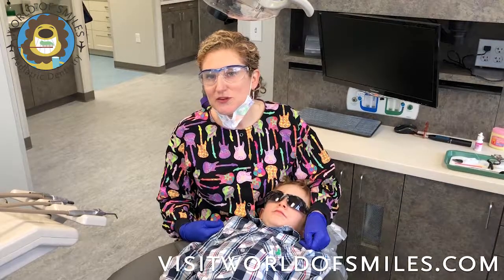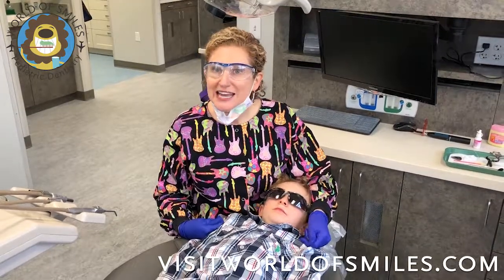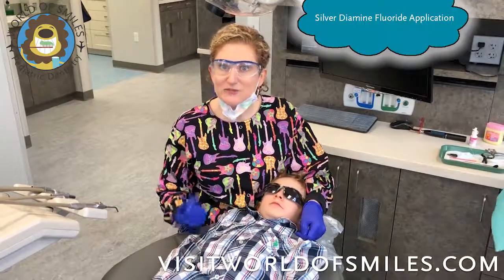Hello, I'm Dr. Michelle Stafford at World of Smiles Pediatric Dentistry, and today we're going to be demonstrating the application of silver diamine fluoride.